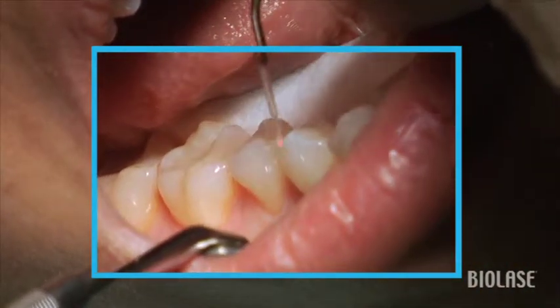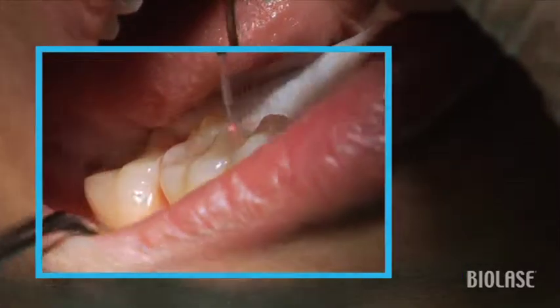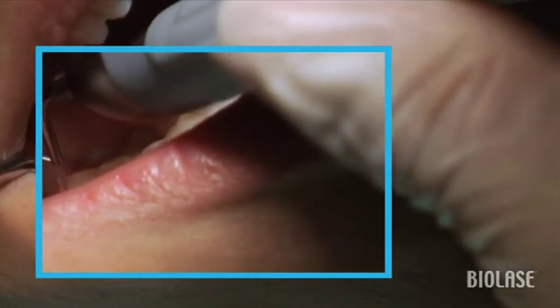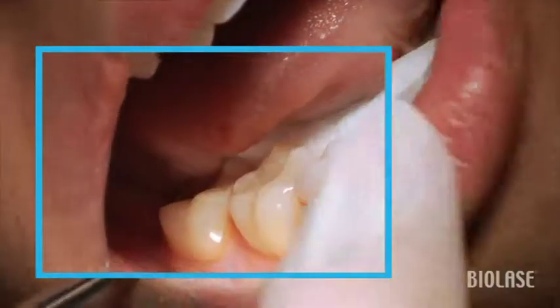Conversely, if we were moving from the mesial to the distal of the mouth, we would start on the distal of the tooth and move mesially, then the distal of the next tooth and move mesially, and likewise throughout the rest of the quadrant. Again, we wouldn't start and end in the same papilla, and we would decrease the amount of thermal damage that might be caused otherwise.